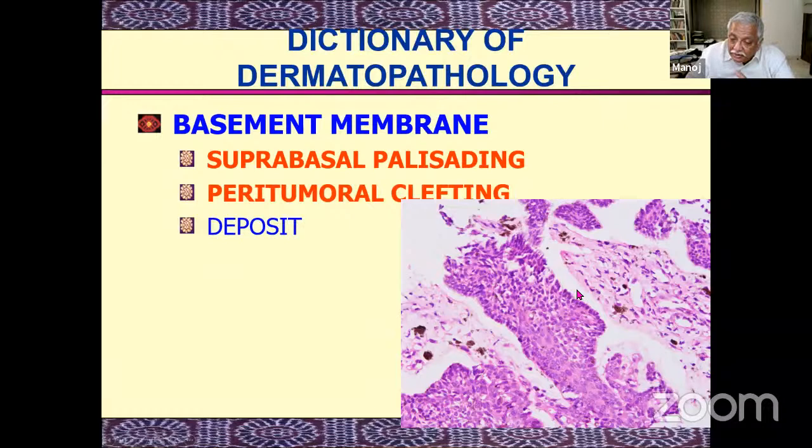And when there is an interaction, the basement membrane does not form as well as it should. The other thing which you can make out is that these cells are in a different orientation from the other cells, right? These cells are elongated. They are vertical, as opposed to these who are lying haphazard. This is known as a palisading appearance.